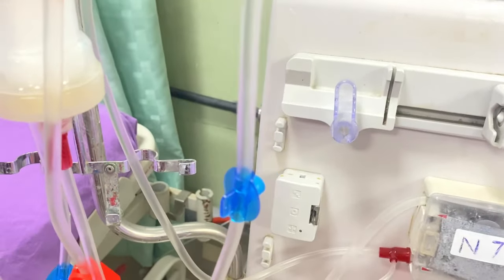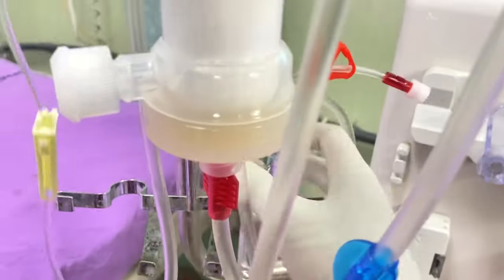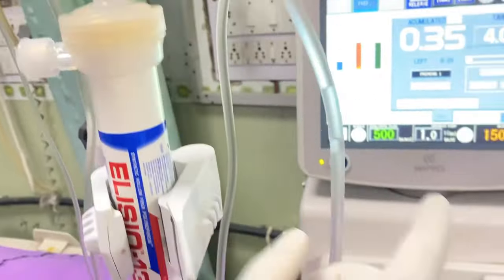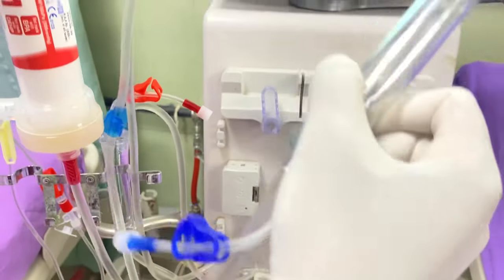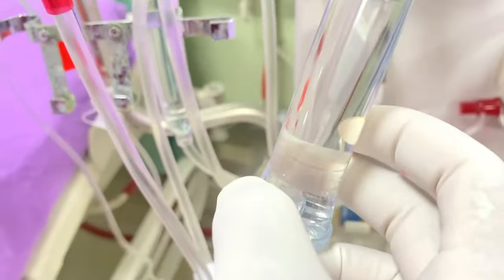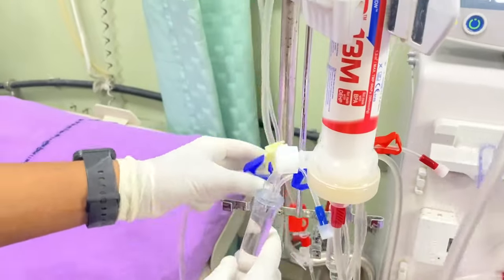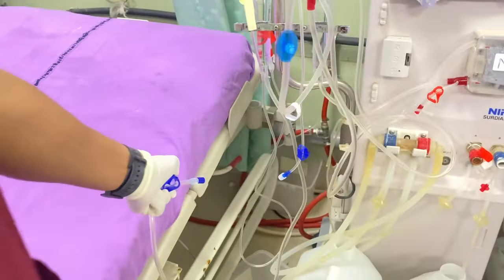You can see here: the left side is the arterial chamber side and the right one is the venous chamber side. You can see the dialyser is filled with saline, and saline comes from the outlet side. Now saline comes into the venous chamber — you can see it filling here. Now the venous chamber is filled. We have to fix it to their side. Both chambers are now filled.